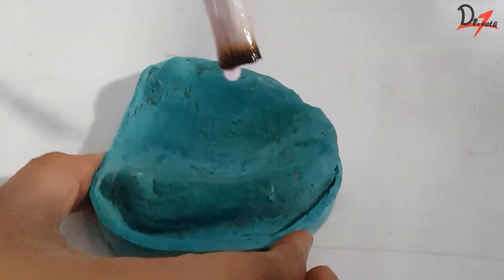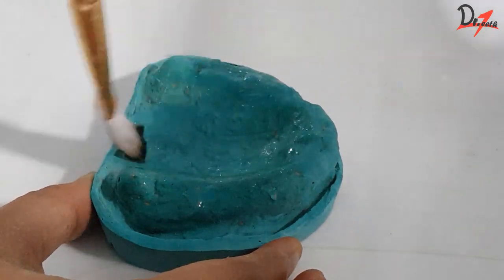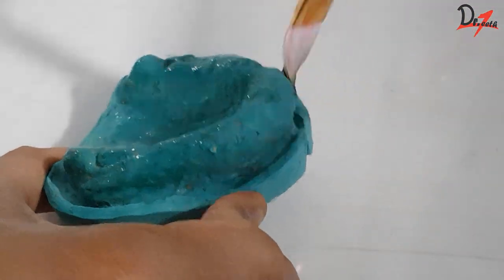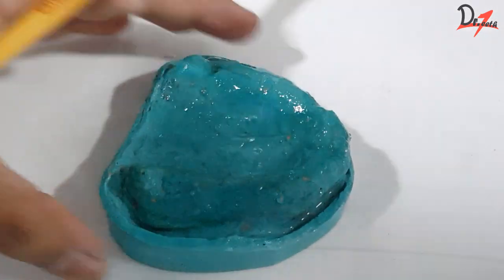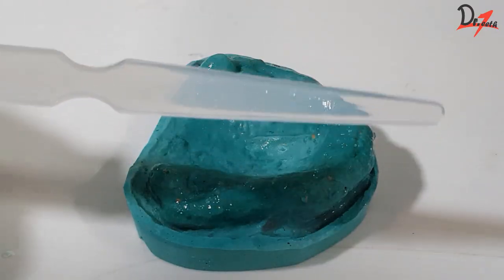Hello everyone, Asalaamu alaikum, I hope that you all are doing fine. We will start by applying separating medium — that is cold mold seal — throughout, and even extend it to the land area. After we are done with this, we will let it dry.